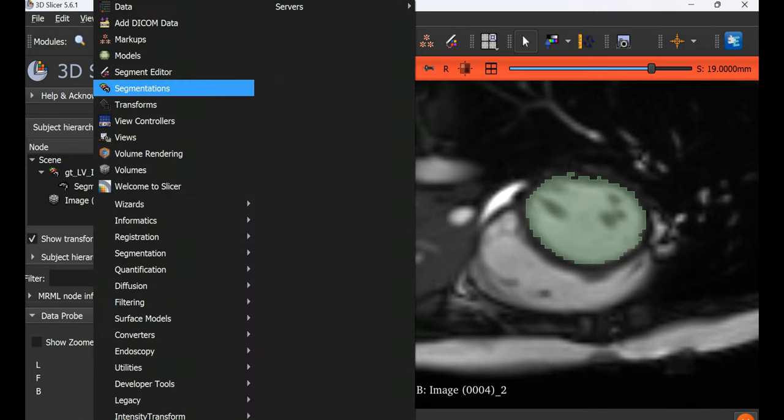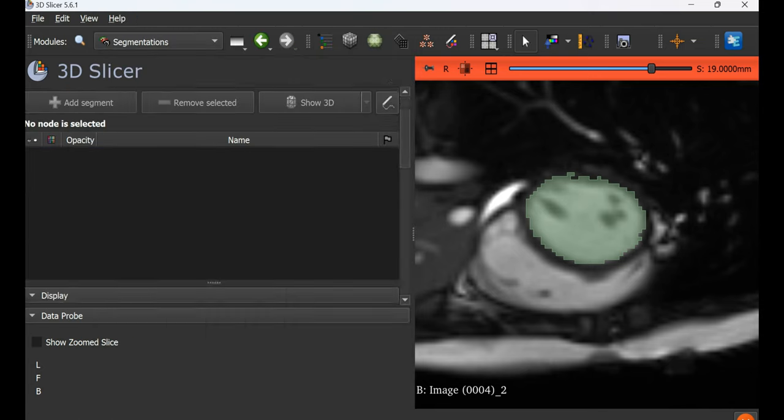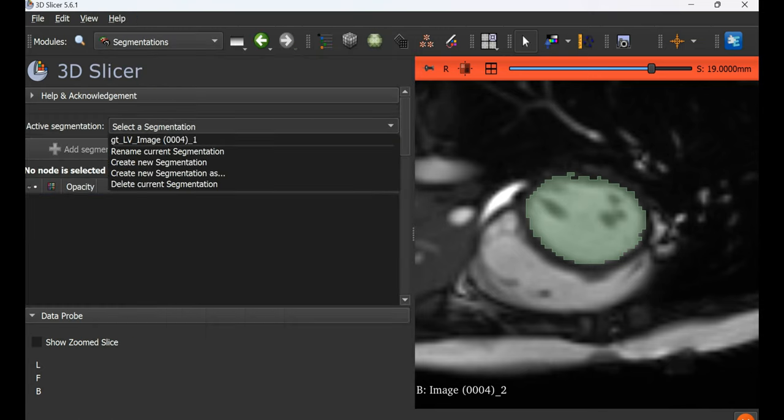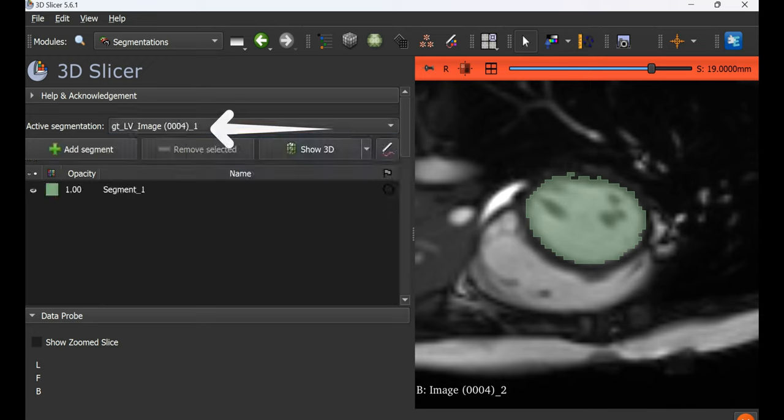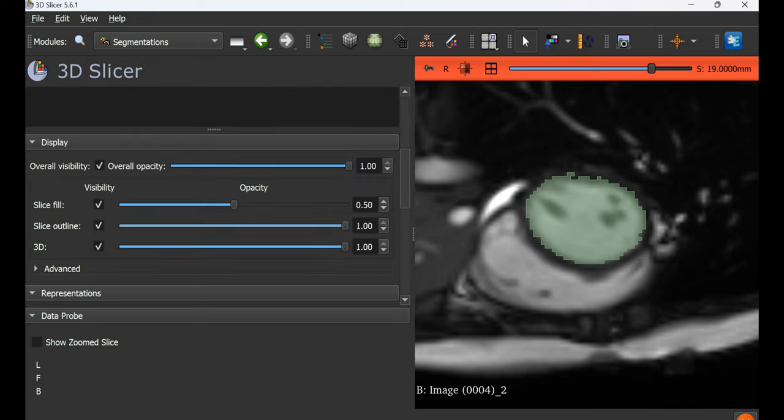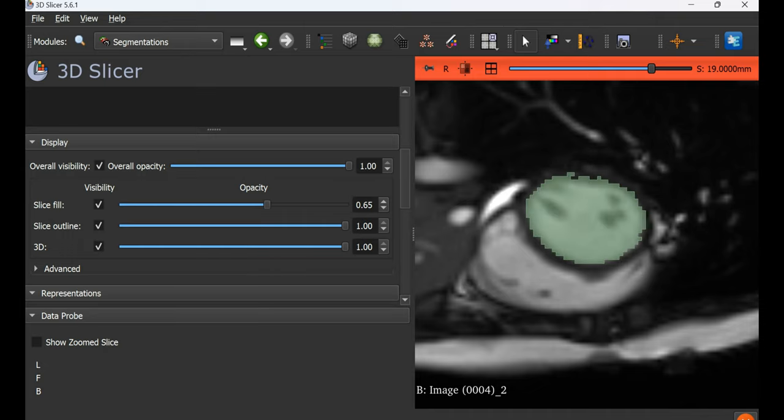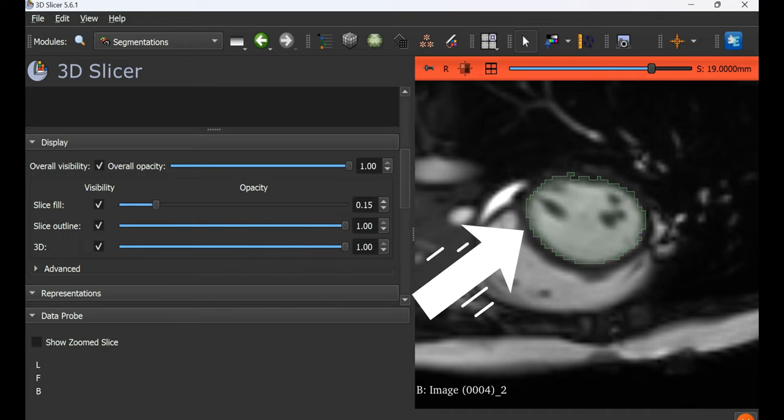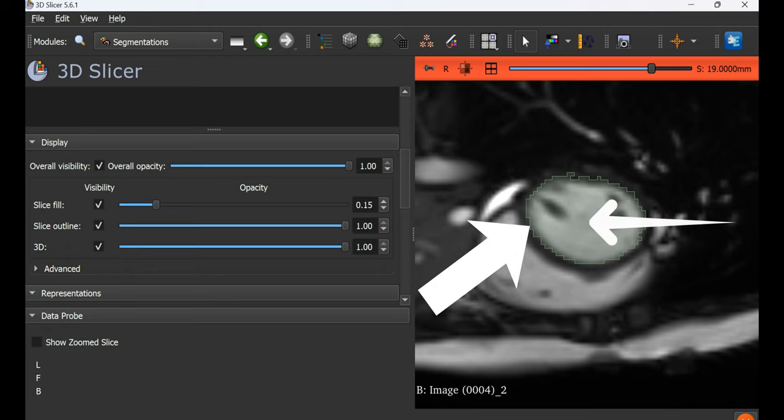We go to segmentation and select our segmentation file which we declared when loading the files. Then go to display and reduce the slice fill so that the background tissue is also visible. Now the boundary is sharp but we can still see through the mask.